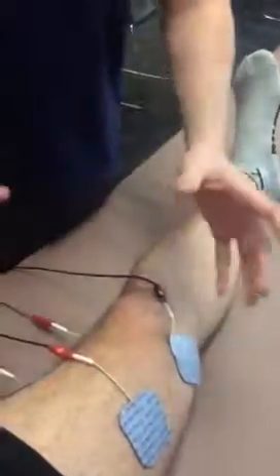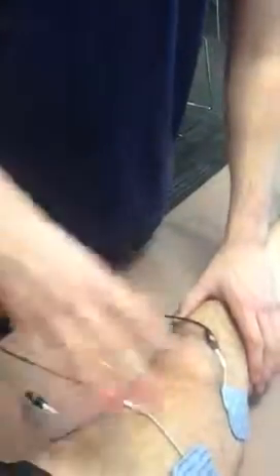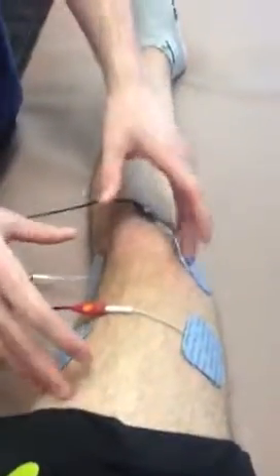Again, with this IFC, same thing as premod, you're going to want to make sure that there are no contraindications that are newly found. You want to make sure the skin's not irritated, they're not in pain, anything like that. I would ask them after the treatment how it felt, if they thought it was effective, or if we need to go more the next time. And I would ask them if they have any questions about the treatment for my last part. And that would be an IFC, interferential, and a premod treatment.